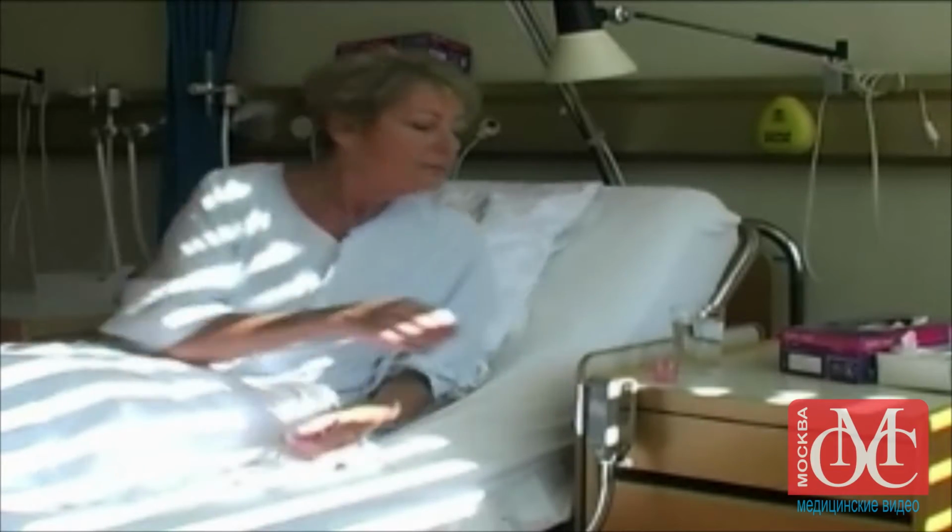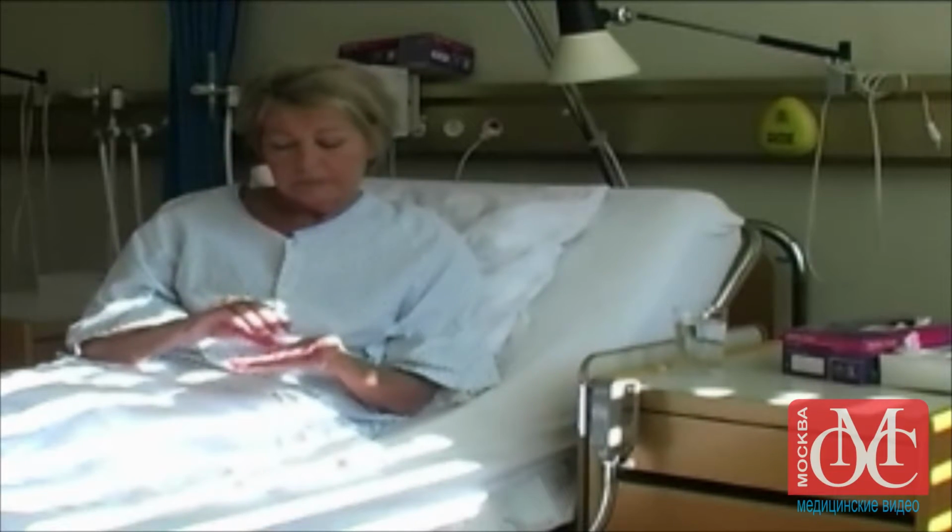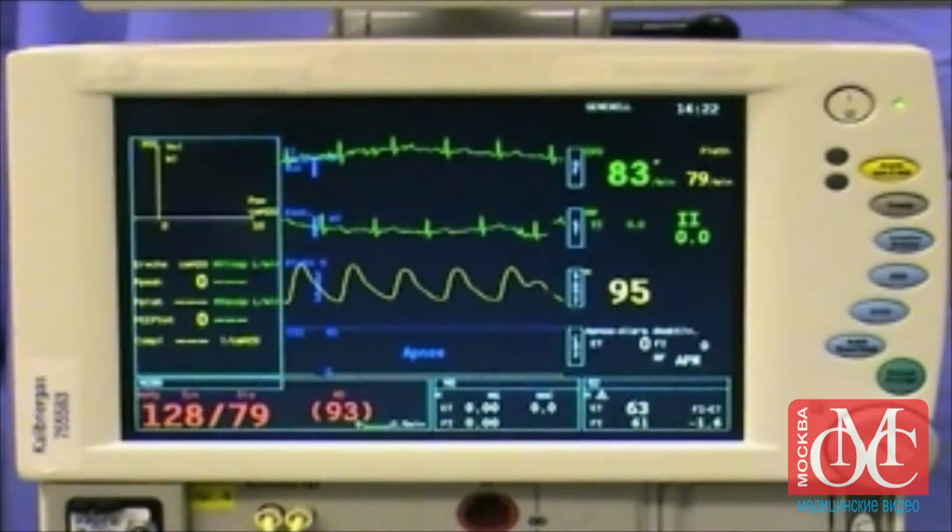The diameter of the flexible fiberscope should be between 3.7 and 4.1 millimeters. Discuss the awake technique with the patient and obtain informed consent before surgery, preferably on the day before the procedure. Give the patient an oral medication with mild sedative effects, for example 0.15 milligrams of clonidine by mouth 60 to 90 minutes before surgery. Explain each step to the patient.